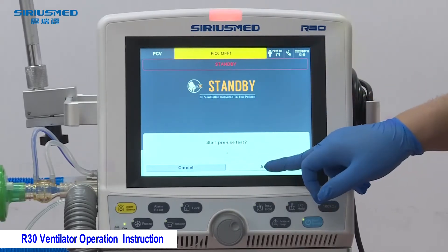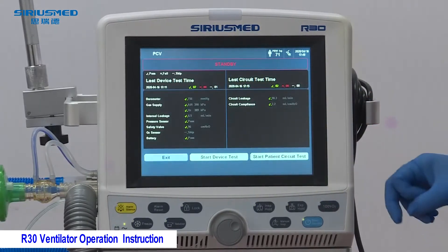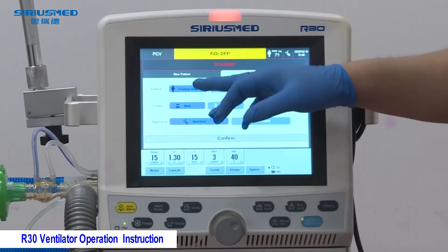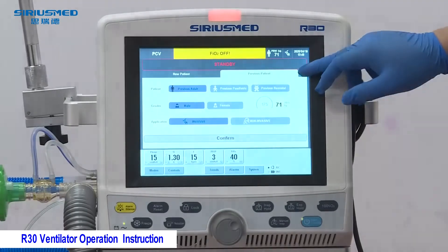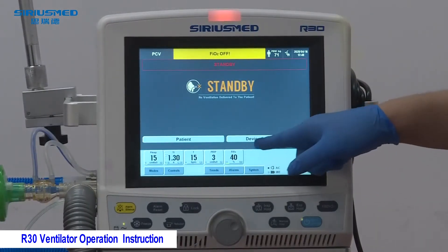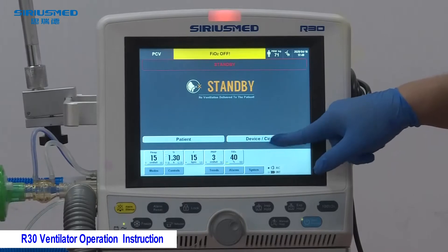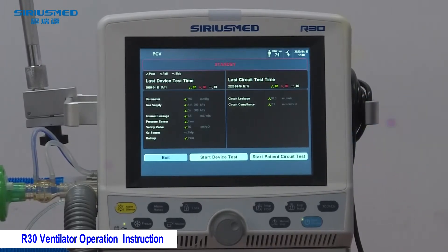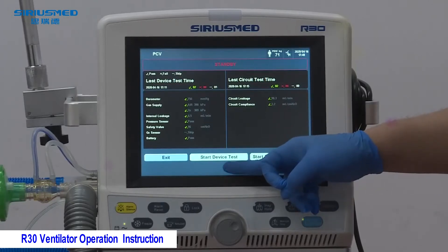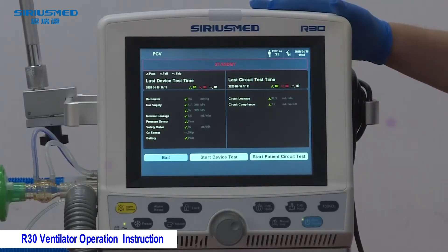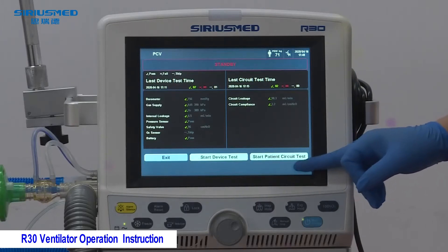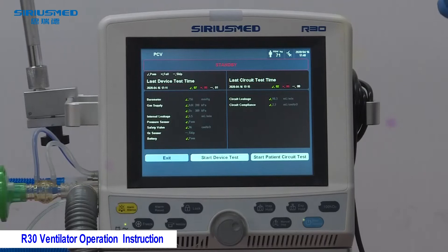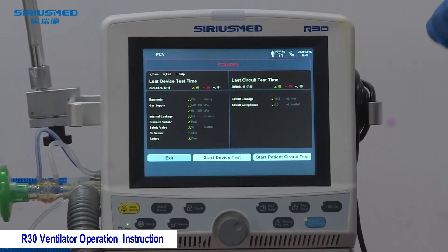After turning on, there is an instruction asking if you want to enter the previous test — you can accept. There is another way to enter the test from the standby interface: select the device circuit test. There are two kinds of tests: one is the device test to make sure the machine has no problem, and the other is the patient circuit test to check if the circuit is working properly.